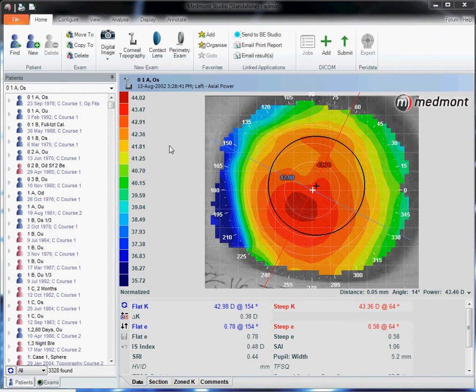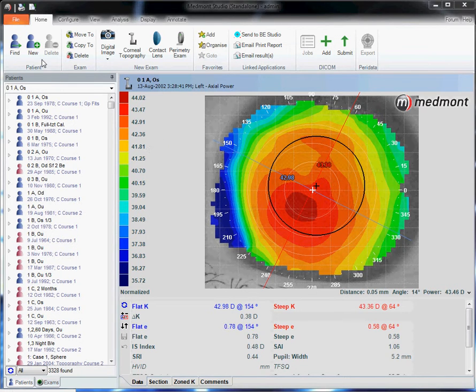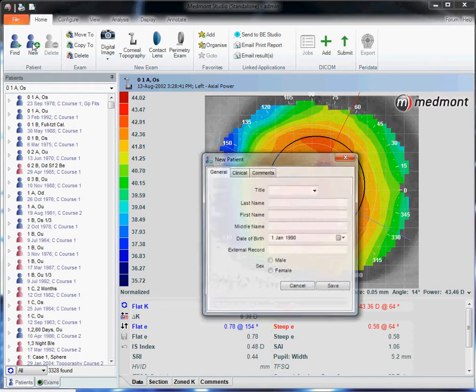This video describes some of the patient management options available with your Medmont E300 corneal topographer. To create a new patient, go up to home and new.